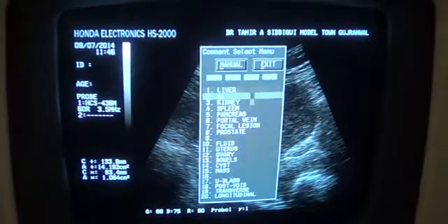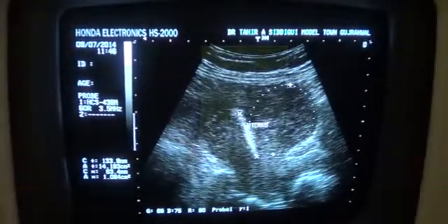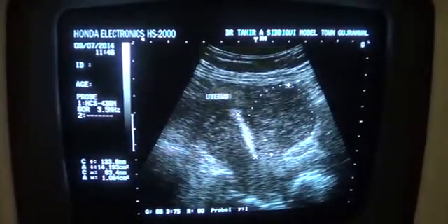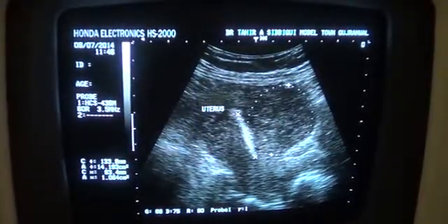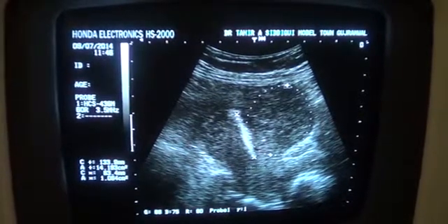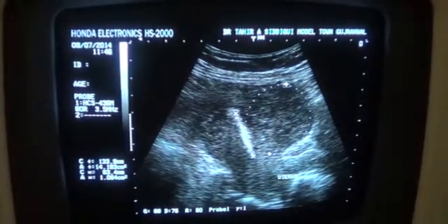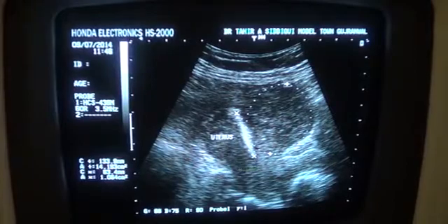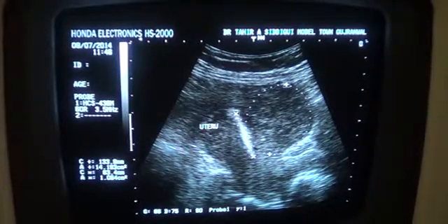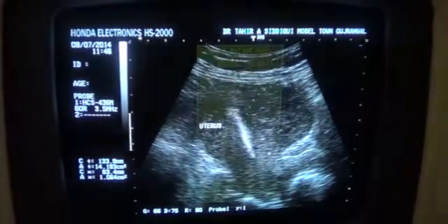This is the uterus. Fundus of the uterus, posterior wall of the uterus, the cervix and the cervical canal — and this is the longitudinal section.